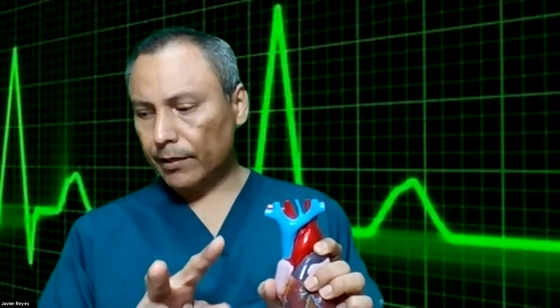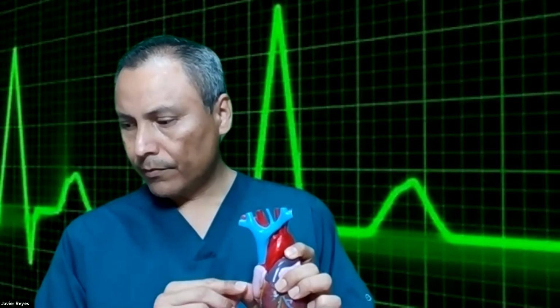So no problem there. The only problem is where again? Where did I say the problem? What section of the EKG? From here to here. What do you call this? I can't remember. The PR. P to the R interval. This is where it gets longer. It's going to be beyond 0.20 seconds or beyond 5 little squares. When that happens, you have yourself a first degree.